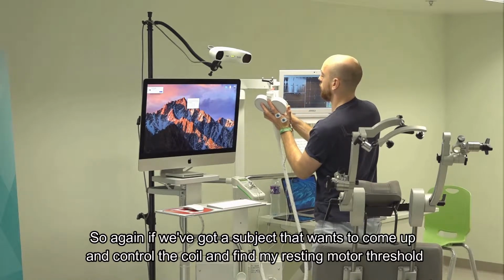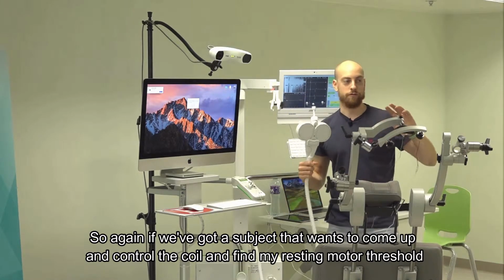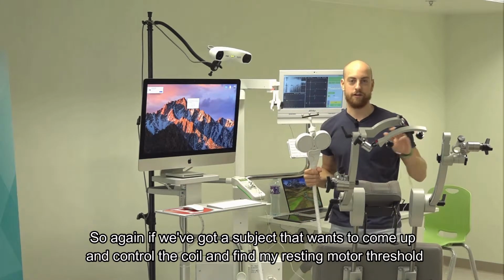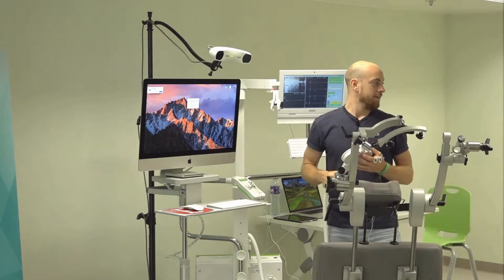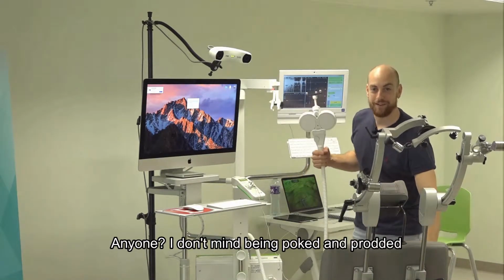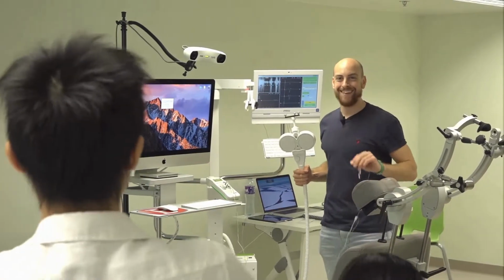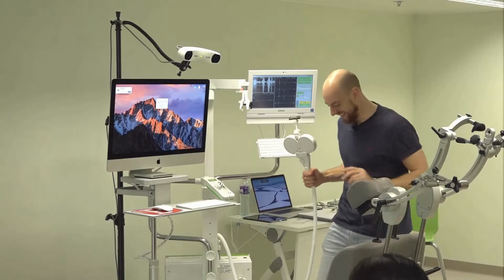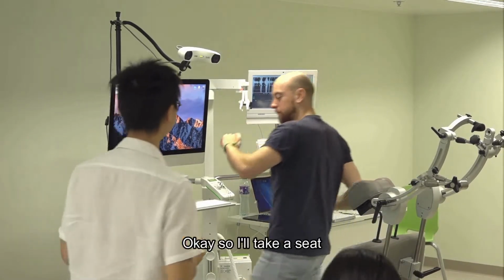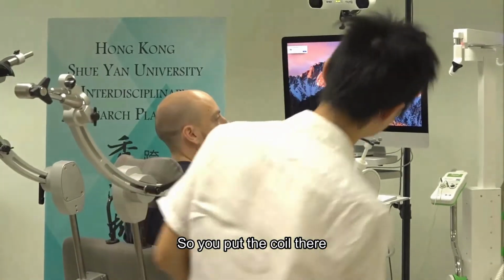So again, if we've got a subject that wants to come up and control the coil and try and find my resting motor threshold. Anyone? I don't mind being poked and prodded. You fancy it? Okay, so I'll take a seat. So you've got the coil there.